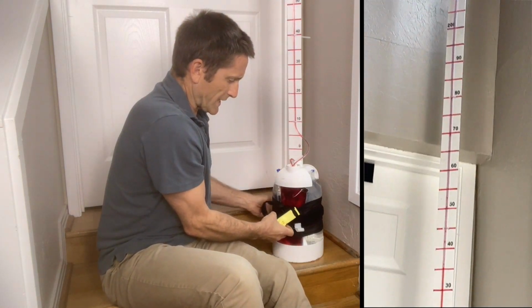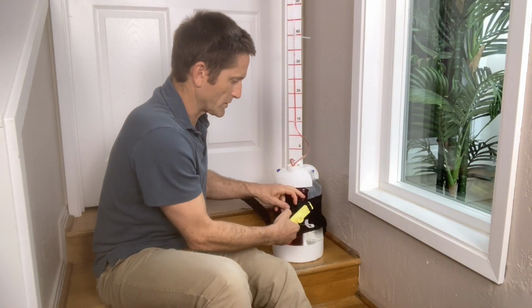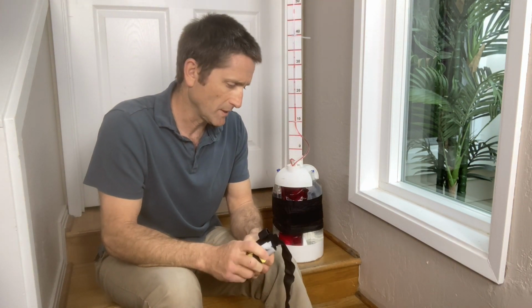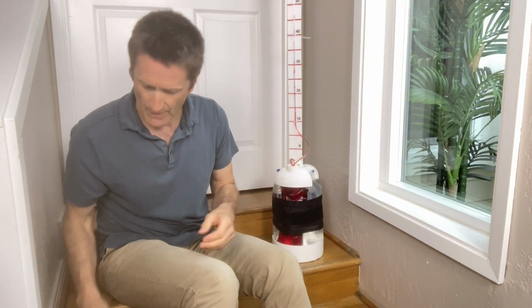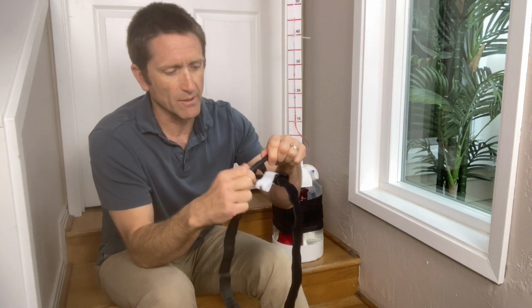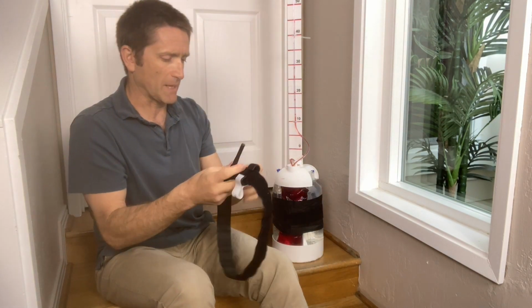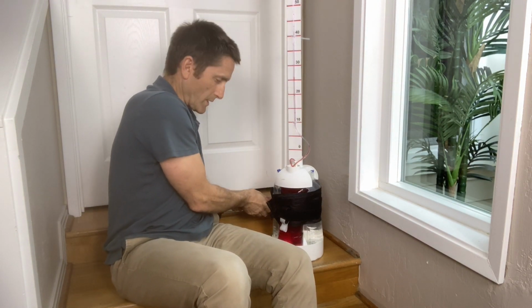Some people would call this a cat knockoff, and there are aspects of it that don't look as good or as sturdy as the original, but I'd say that this is similar torque, similar peak pressures from this model. This is another one, and one of the tells here is this type of windlass. So I would say if you see this older type of windlass, beware. Let's see what happens. Let's see what kind of pressures we get and the associated torque.